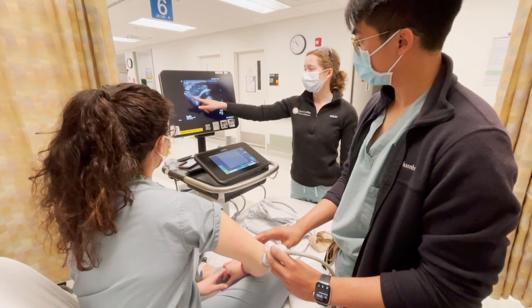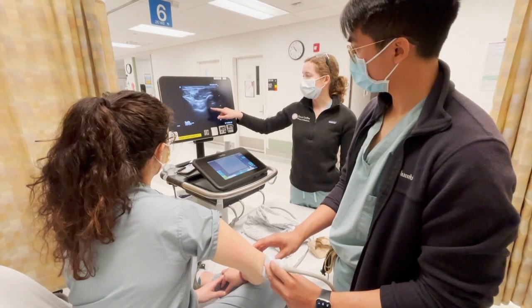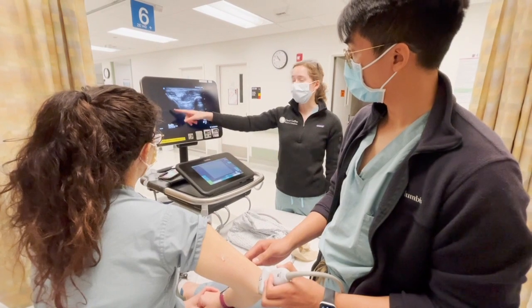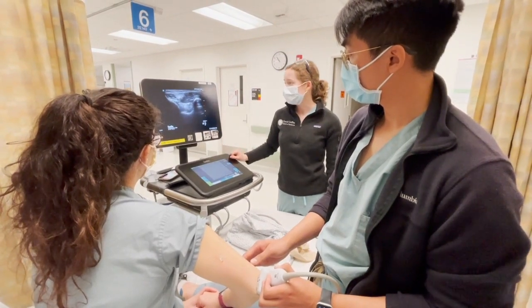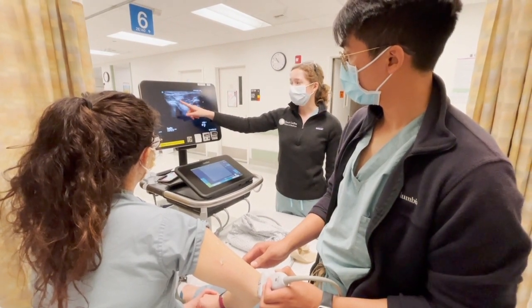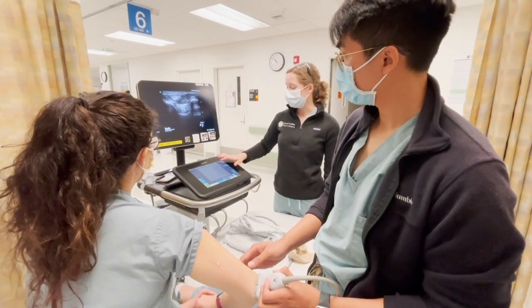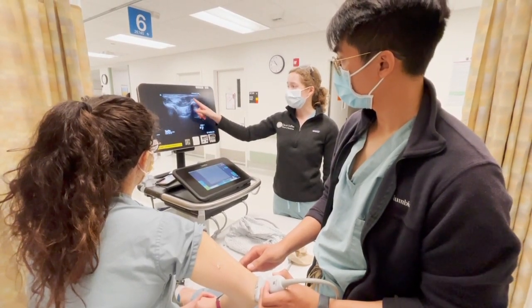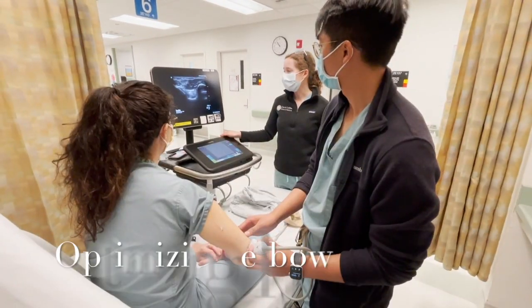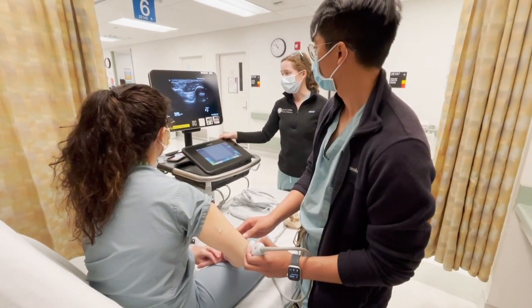We get a short axis view of the olecranon fat pad and olecranon fossa, then see the lateral and medial epicondyles — medial will be towards the probe indicator. You can also see an echogenic area which is likely the triceps tendon; it's a little bit brighter than the surrounding triceps muscle, which is a little bit more hypoechoic.